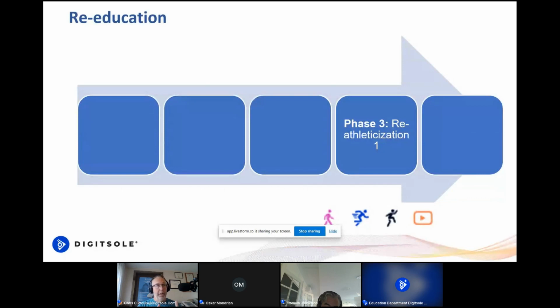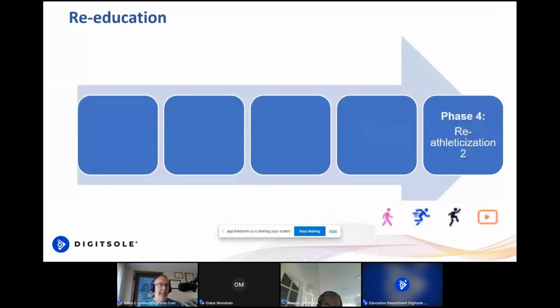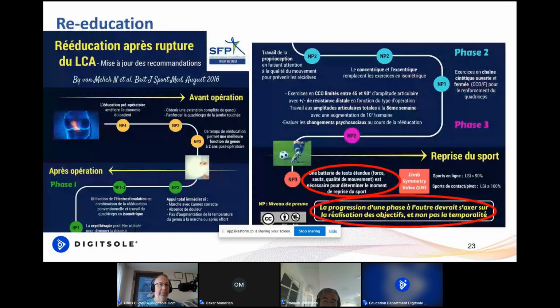Now, we may also be testing, and we're looking at a comparison between the injured limb and the non-injured limb. And that's where our focus at the end of the rehabilitation process is. We want those to be as close as possible. So we have various ways that we can measure that. And that's where the performance rehab module actually came into play, is we're going to be able to use that throughout the cycle.